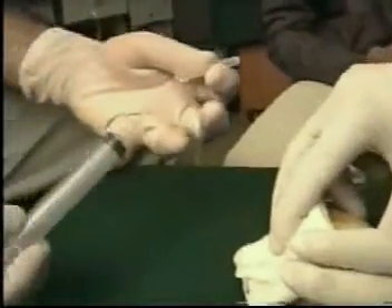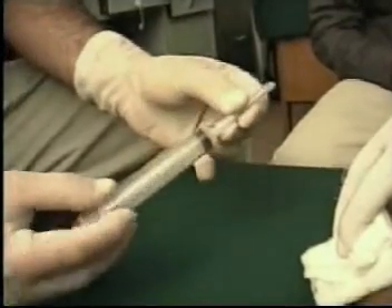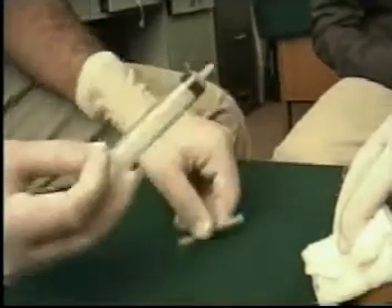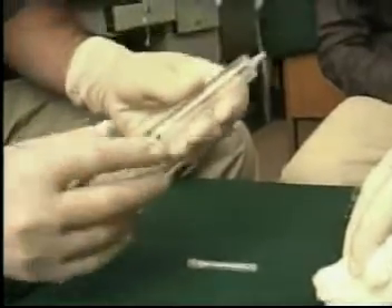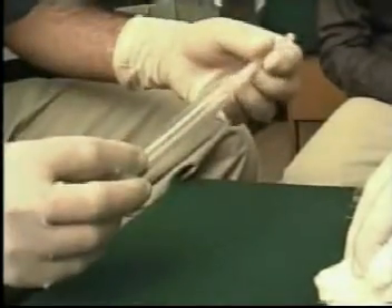Hold the area where you have taken the FNA from and apply finger pressure. Reapply the cap of the syringe and remove the needle. Then suck air into the barrel and reapply the needle.